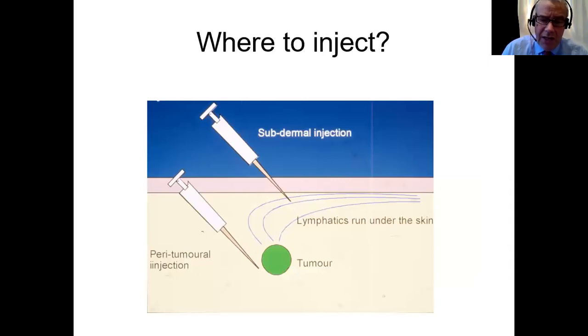So where do we inject? Originally, people injected peritumorally, but more recently, people have preferred the injection subdermally, and that's the technique that we normally use.